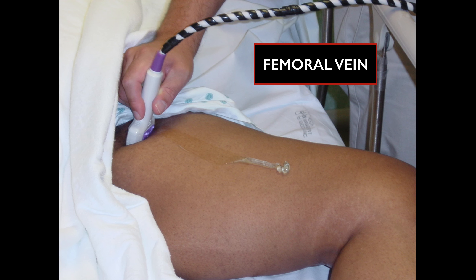To frog leg a patient, you externally rotate the hip and flex the knee. You can place a pillow underneath the knee to make them more comfortable. This really opens up the area you're going to scan, including the knee area when you do the popliteal vein. Apply gel all across the leg so that as you scan down you don't have to keep reapplying.